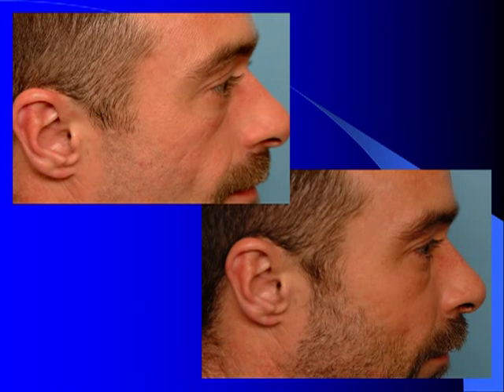I have used this commonly in a variety of patients and find it to be a very simple and satisfying procedure. Again, it may be necessary in some patients to supplement the areas with fat injections, as the submalar cheek implants will only go so far in terms of covering the defect. Fat injections may be needed above the lip area out into the sides of the face if the fat loss is more significant.